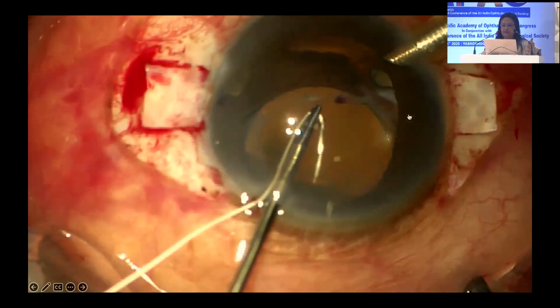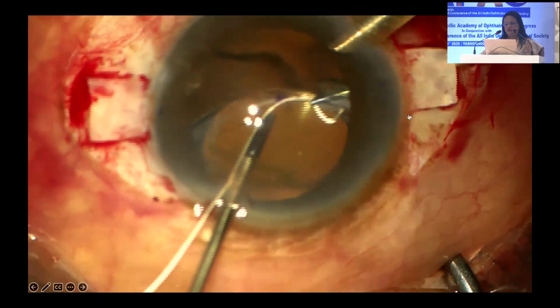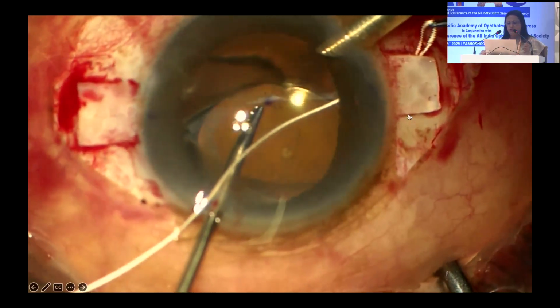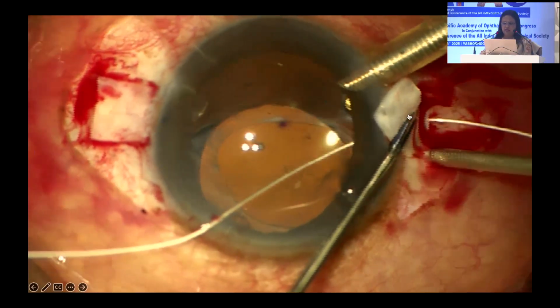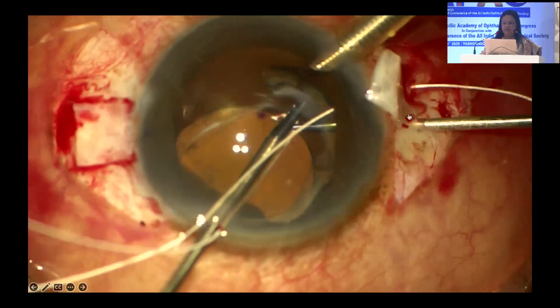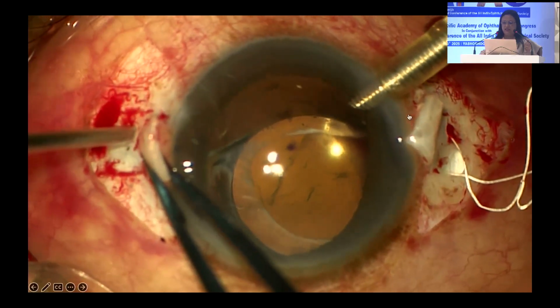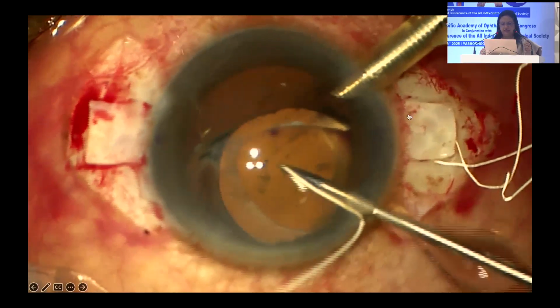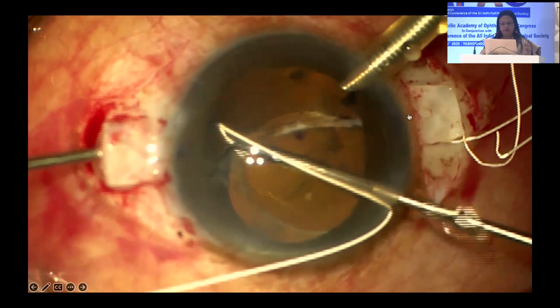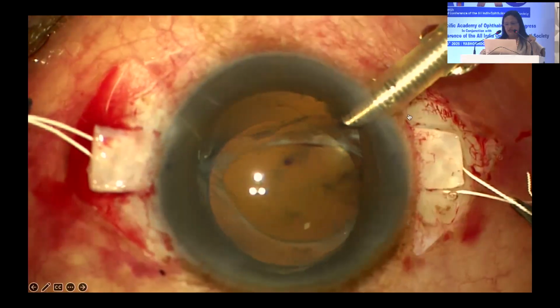So you can see, I'm just taking the Gore-Tex suture and retrieving it from under the haptic. One portion of the Gore-Tex suture goes under the haptic, the other one goes on top. You have to make a larger incision, because it's a slightly larger suture, it is very thick. The same thing is repeated on this side. The first one goes on top, the second one goes to the bottom, so that there is no torque of the lens, so that the lens doesn't twist.